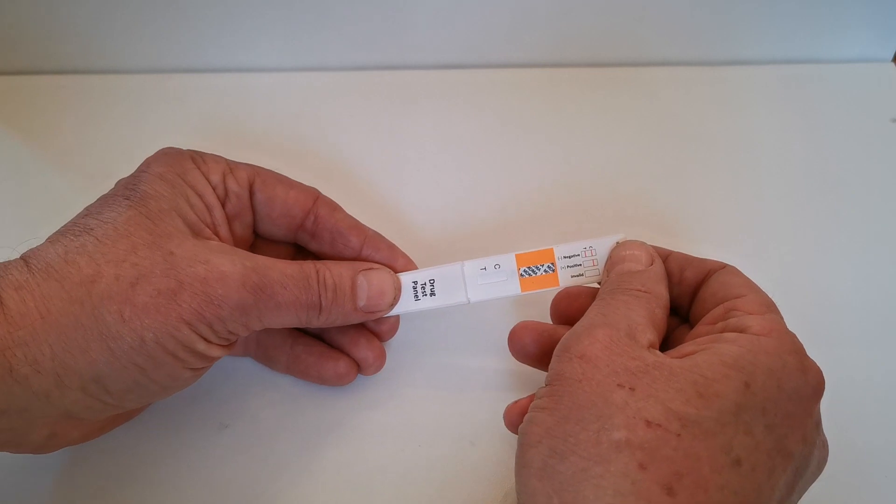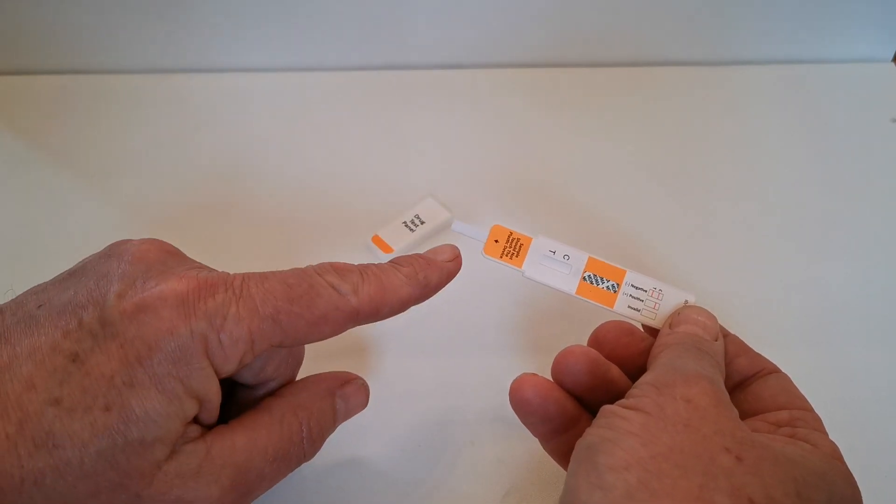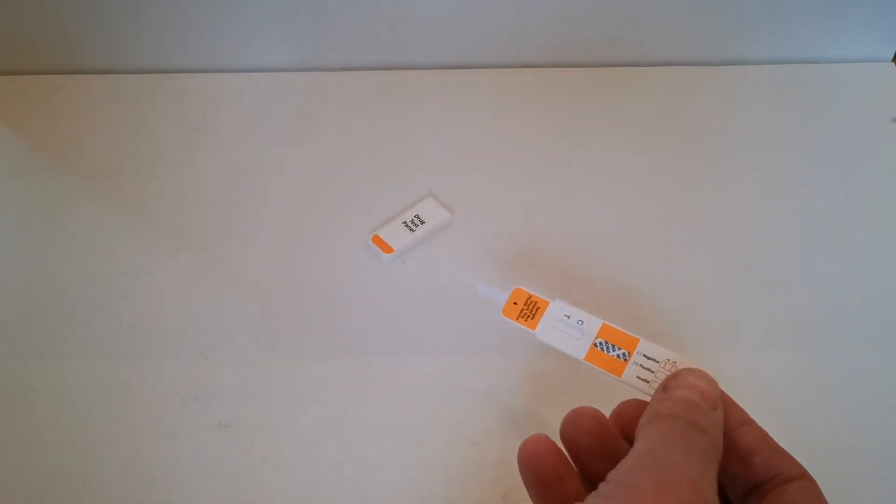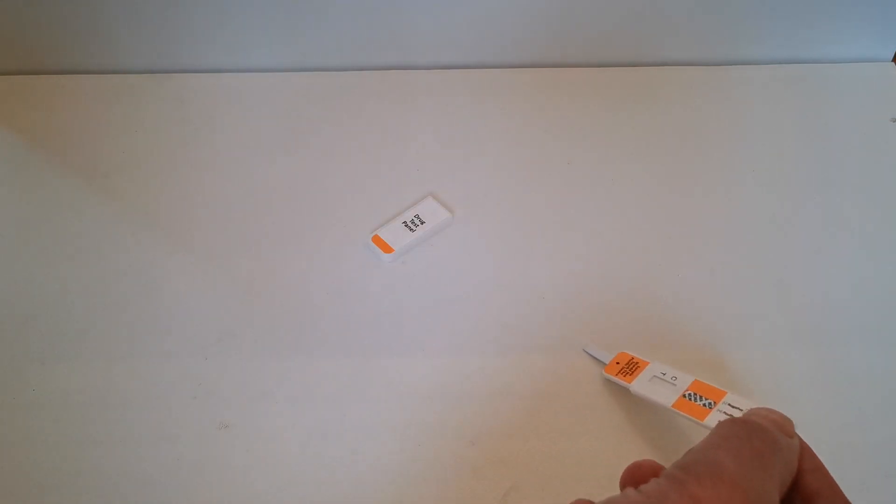To run the test, remove the cover, and this is the drug test cover. What is revealed is this prong. Now to use this as a surface wipe test, all you have to do is wipe the prong across the surface that you're looking to screen.